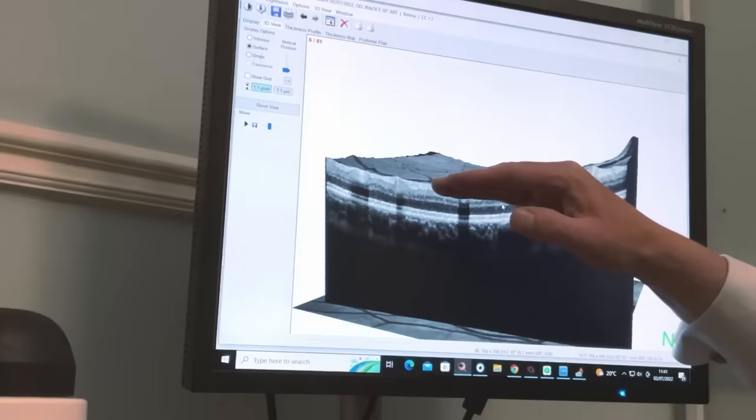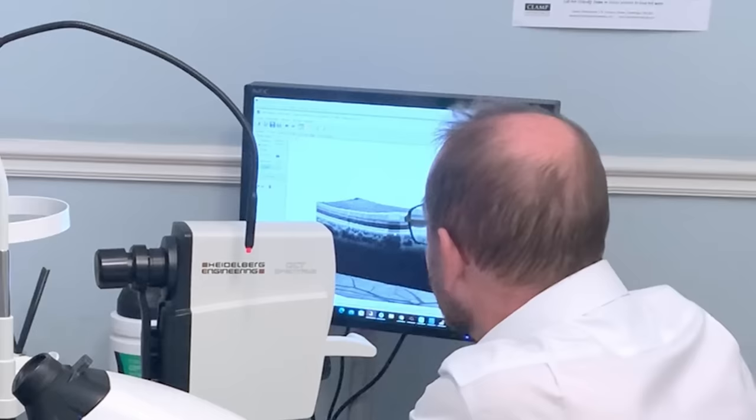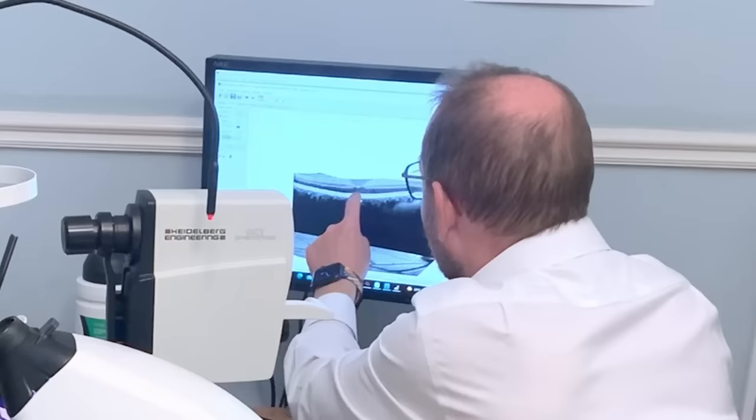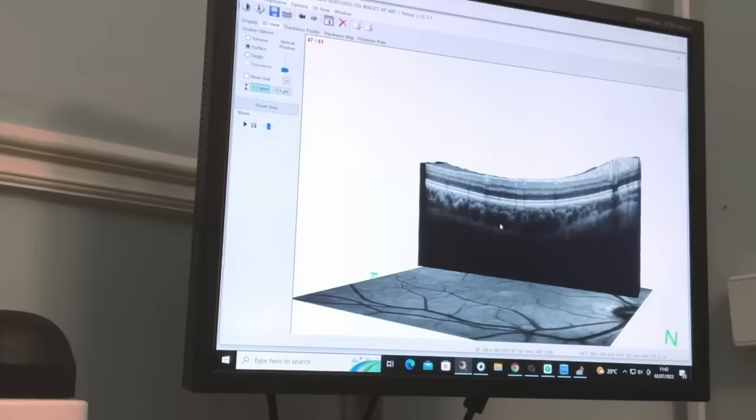If we slide through it, each beep when it was taking the scan was a cross section through it, and then it creates this block which we can look at. In a minute we'll get to the centre of your macula, where the detailed vision is. If we look from above, that's where it dips, and that little reflex point is where there's the highest concentration of the rods and cones for the detailed vision. So that all looks really good. It'll be the same with the other one. Let's have a look.